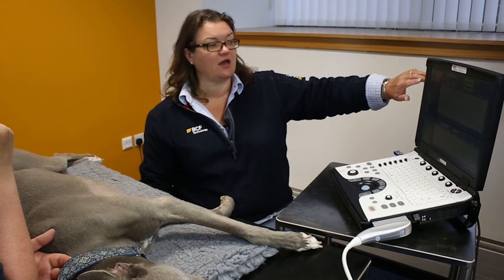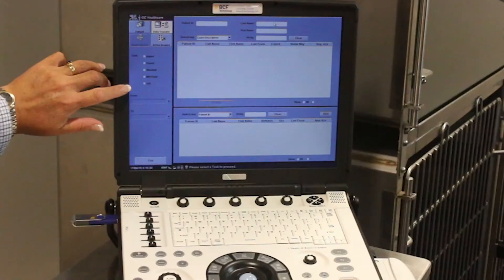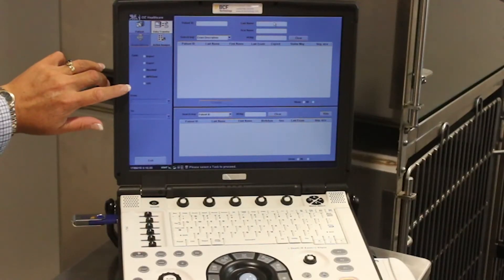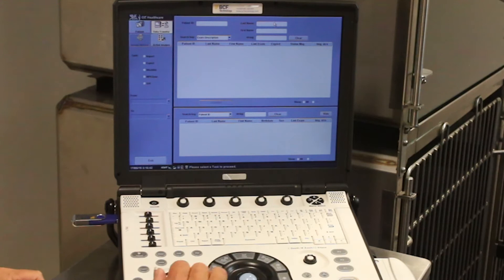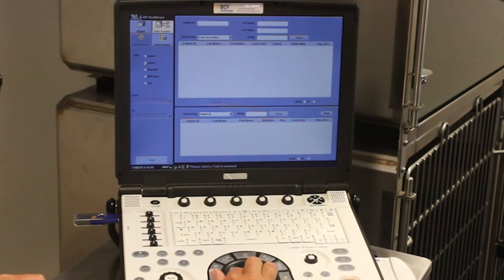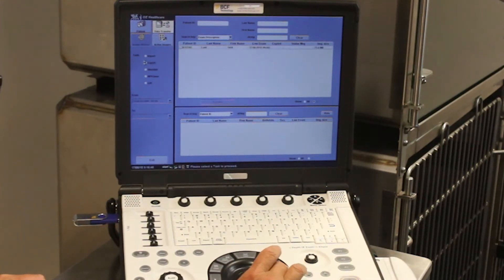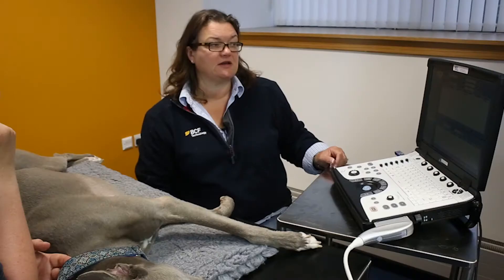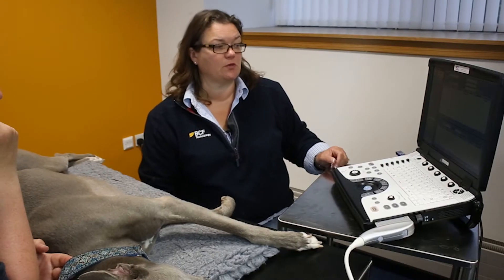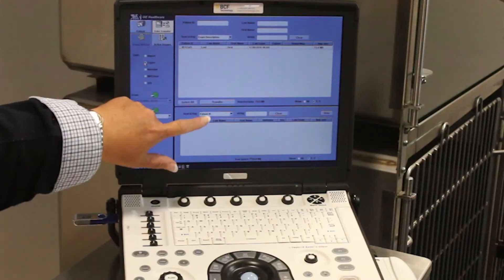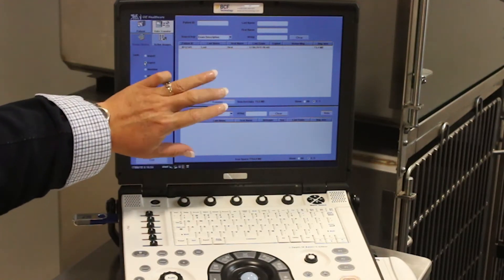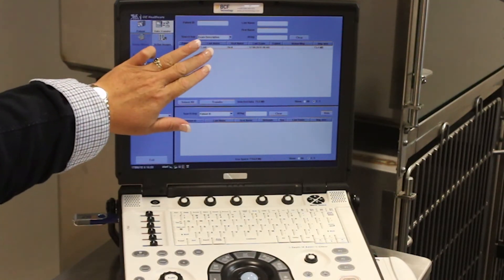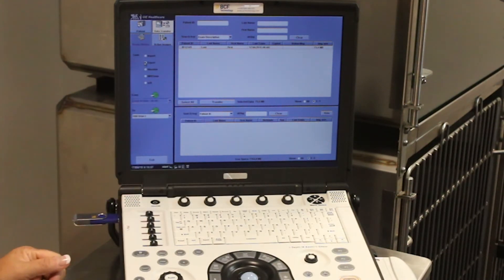You'll see now that I have various tasks listed down the left-hand side, and the one that I'm interested in is export. When I click export, you'll see that I have two screens come up on the top part of the screen and the bottom part of a split screen.